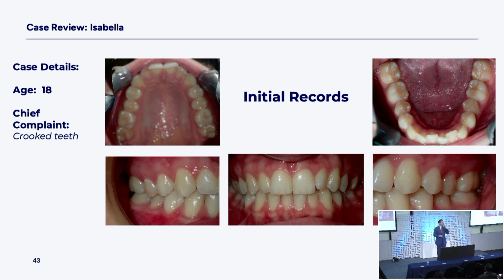So I'm either going to develop space at the upper lateral, or to solve the upper spacing, you can do lower reduction, lower IPR. So there's a pathway to account for upper lateral deficiency. A tooth size discrepancy at the upper lateral means you either have to choose between adding to the upper or subtracting from the lower. And it's very easy to subtract from the lower because everybody loves their IPR so much. So chop up the lower teeth to get them out of the way so you can have the top with no space. That's one way to do it.